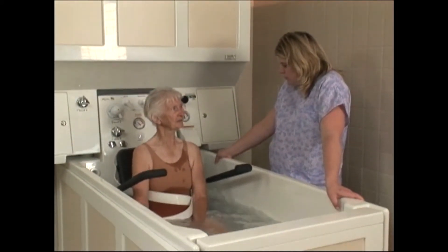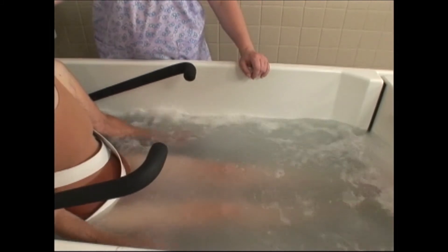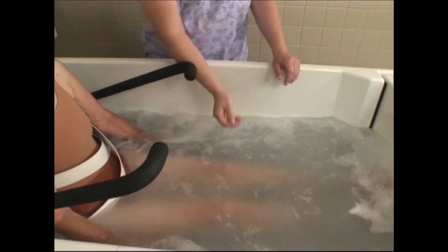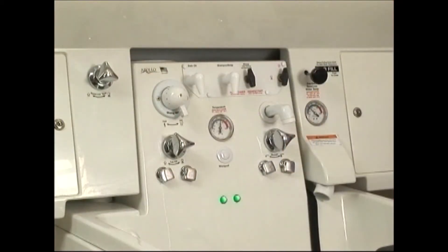With the tub filled, push the whirlpool button. This activates the four jets for maximum water circulation near the back and arms, the perineum, and by the feet, to provide a cleansing, therapeutic, and relaxing massage.